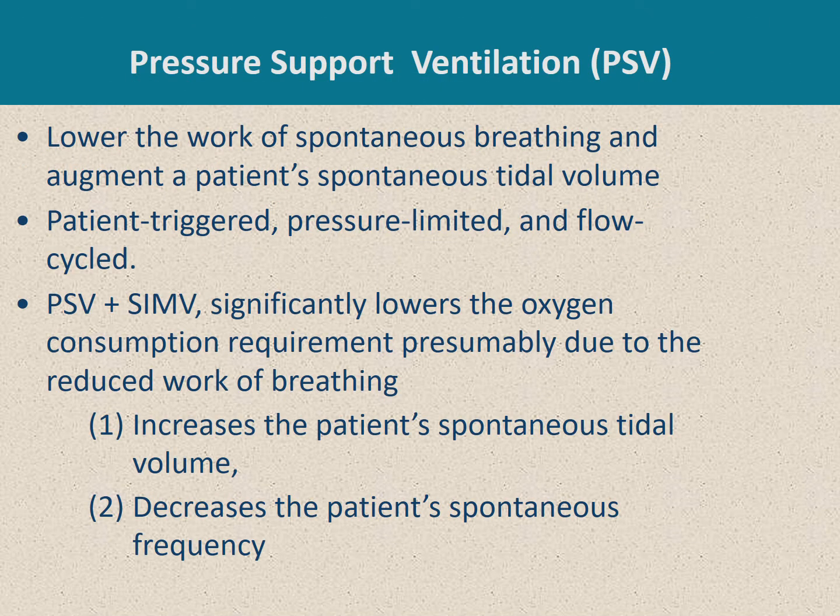The first mode of spontaneous breathing is pressure support ventilation. Basically, it's a pressure controlled ventilation, meaning it's a pressure limited, patient triggered, and flow cycled ventilation. There is no rate to set. The patient controls the rate, and the patient triggers the ventilator each time he inspires.